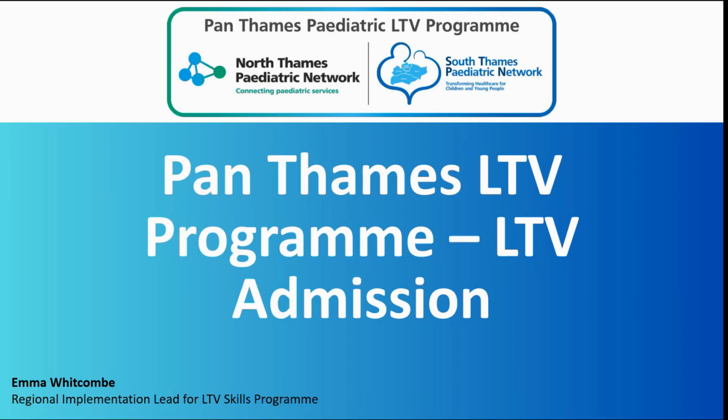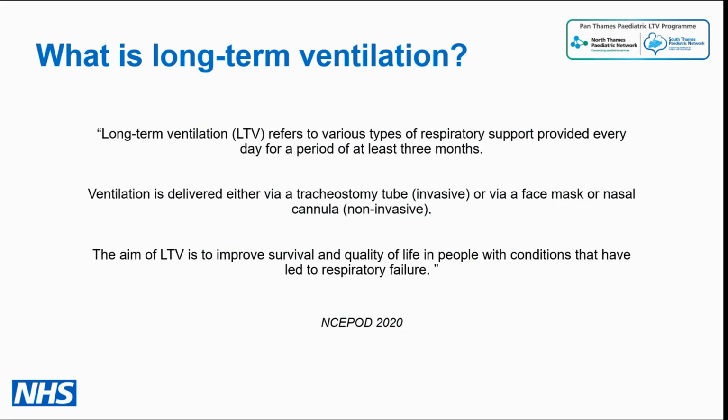Because this was an acute webinar, I wanted to just recap what LTV is. I'm really sorry if everybody's really happy with what LTV is, but LTV refers to the various types of respiratory support provided every day for a period of at least 3 months. Ventilation can be delivered either via a tracheostomy tube, which is invasive tracheostomy ventilation, or via a face or nasal mask, which we call non-invasive ventilation.